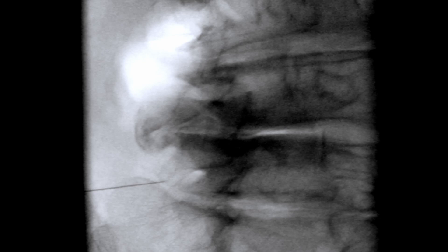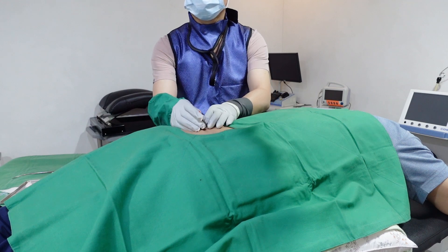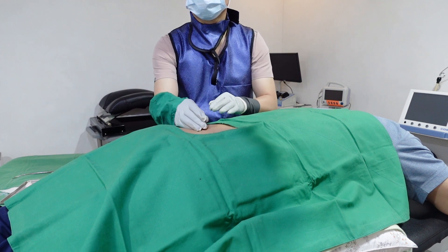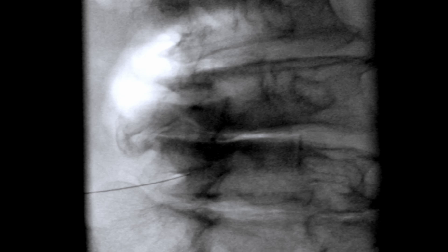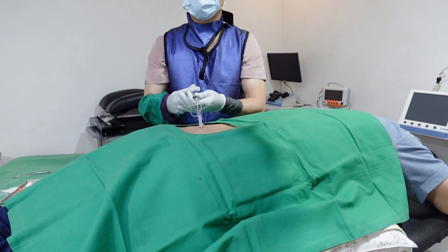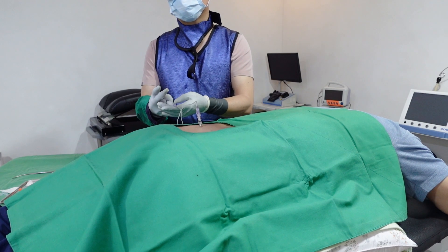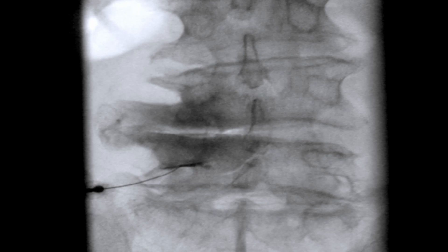The needle is then advanced cautiously and deliberately. To administer contrast media, an extended mini-volume tube is utilized. This approach allows for the observed efficient spread of contrast media into the subradicular root sheath and the epidural space. Following this step, the C-arm is repositioned to an AP view for observation.